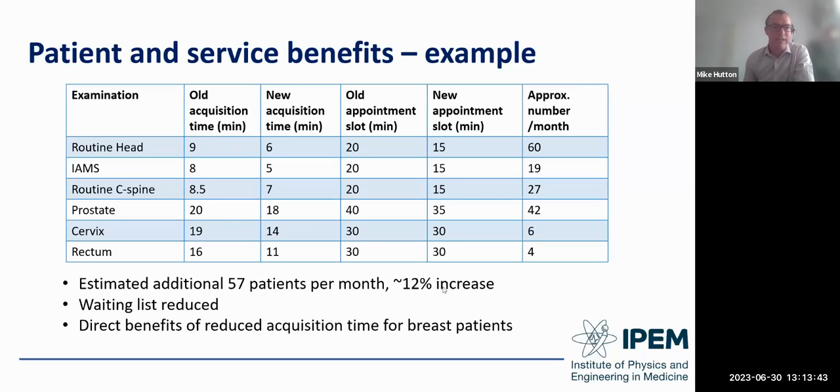If you've benefited from the NHS England funded software, at some point you will need to report back to NHS England whether there've been benefits from this software. And I think you just need to think very carefully about how you can provide reliable and robust data.